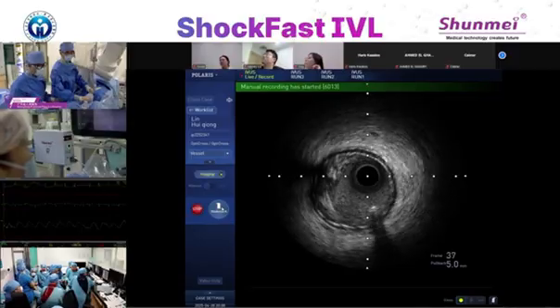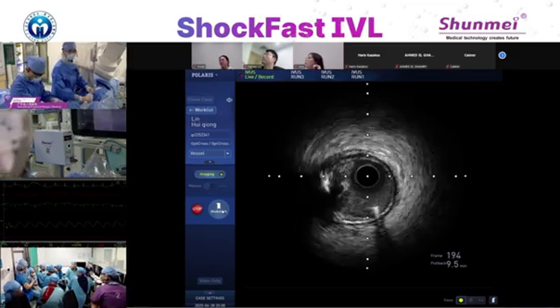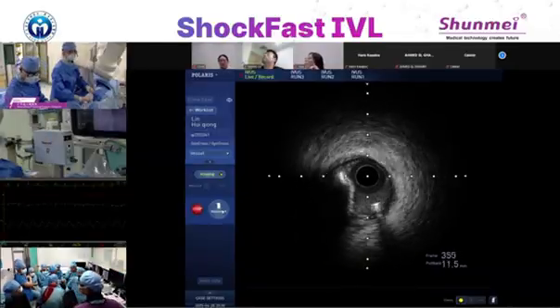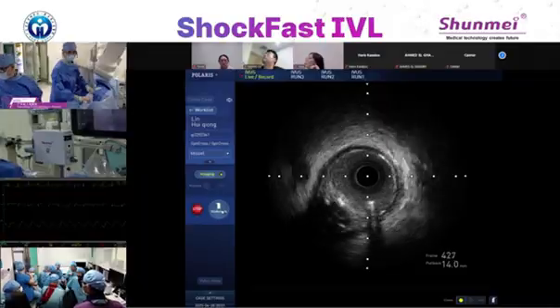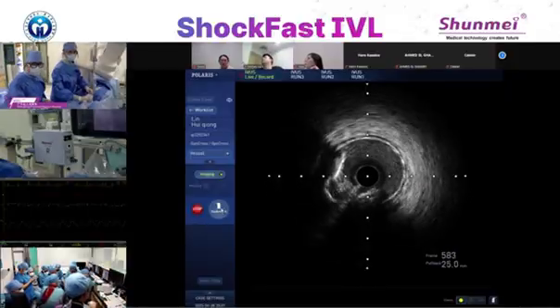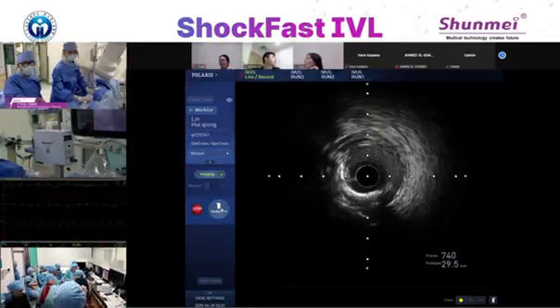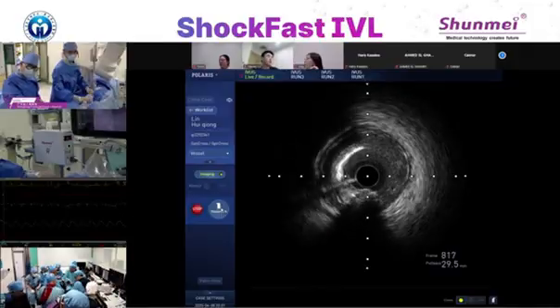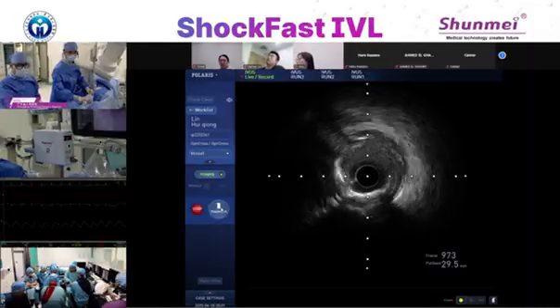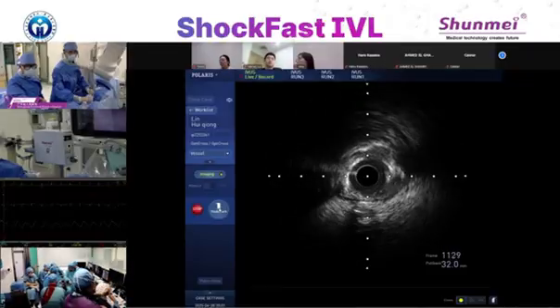Okay, menu. No need to record. Here there's some eccentric calcium. Here. Okay, I think here is where we dilated before. Here is where we dilated before, I think.